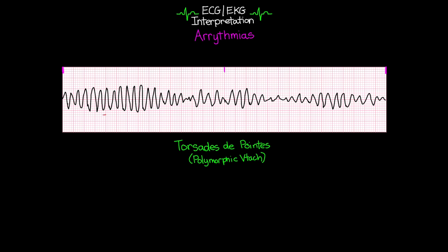If you look at the morphology of these beats here compared to these beats here and these beats here, you can see they're quite different, telling us that these impulses are coming from different parts of the heart and therefore being captured differently on our ECG. More often than not, this is going to be a pulseless rhythm for your patient, making it another lethal rhythm — typically as a result of either prolonged QT or some sort of electrolyte imbalance. Just know that this is a different form of VTAC that you're going to have to be able to identify.